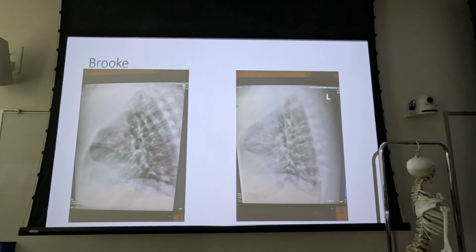I've got an image that we'll look at when we get to upper extremity, where they shot a left shoulder and they put the marker over the spine. That's stupid, right? So in that case, it would be on the lateral side, but as long as you put it in a reasonable place, it's out of the anatomy of interest, and it's on the image, I don't care what you do.